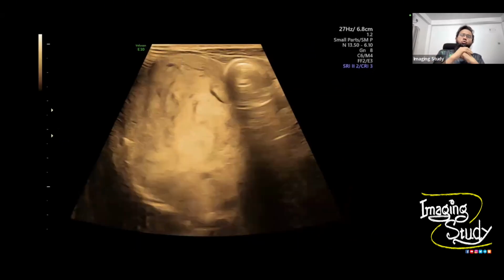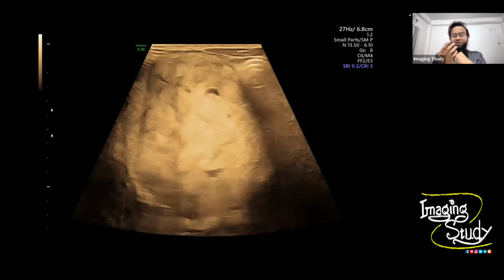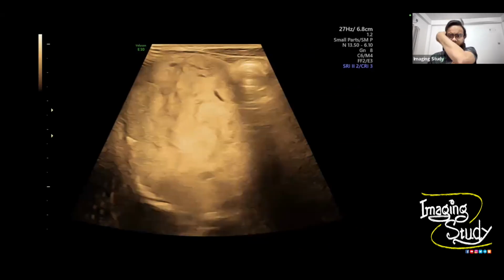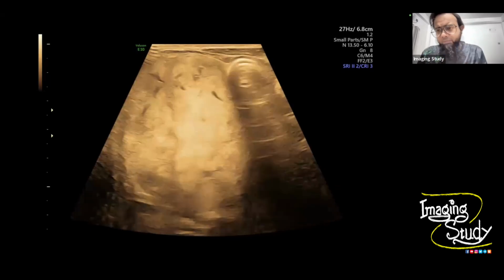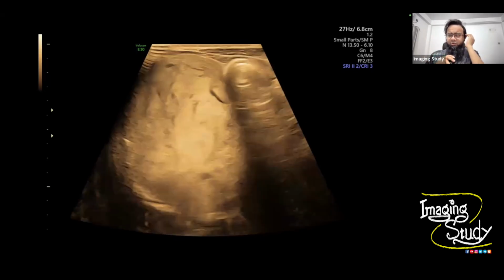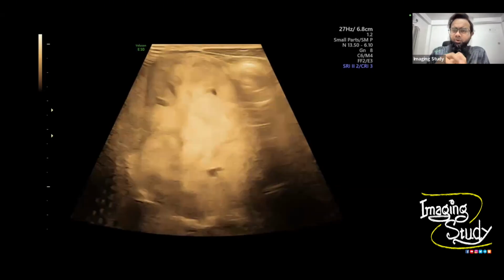The patient went through FNAC and biopsy from this nodule 2 times, and he said that both times the report was normal. There was no malignancy found here, which was quite interesting because it should not be. Okay, so why should it not be? It can be. As this is a big lesion, there should be some confusion, obviously, but you have to search the surrounding region. Okay, anyway, let's see what we have got again in this patient.